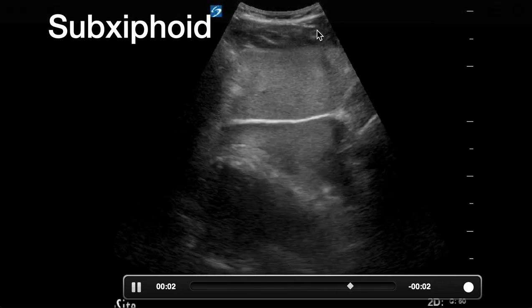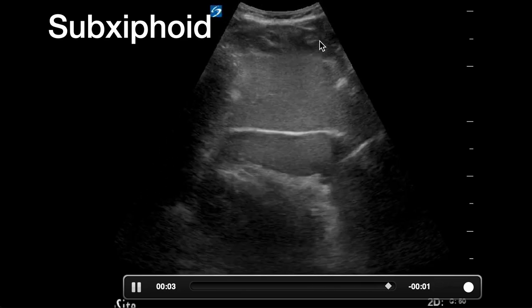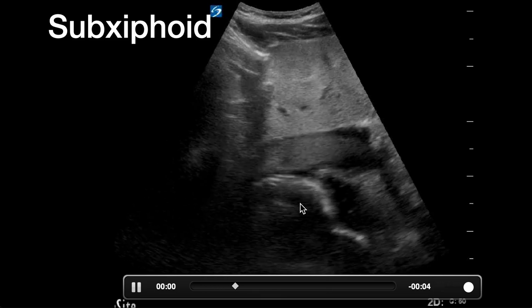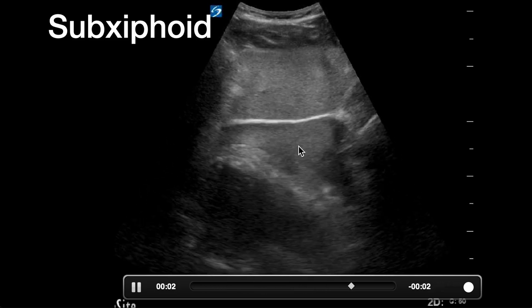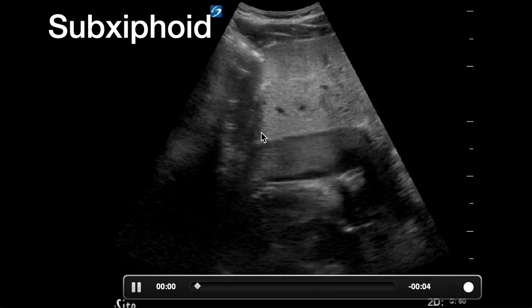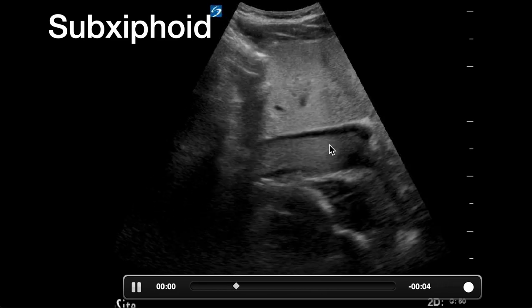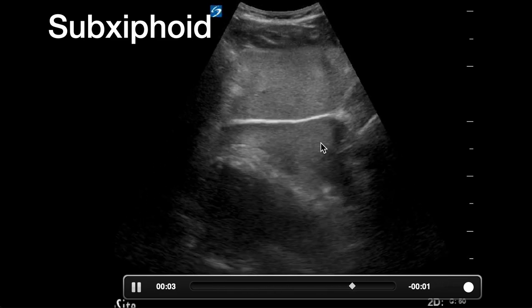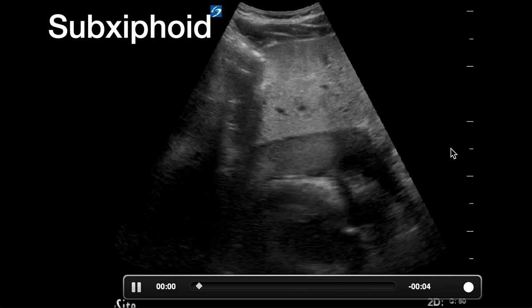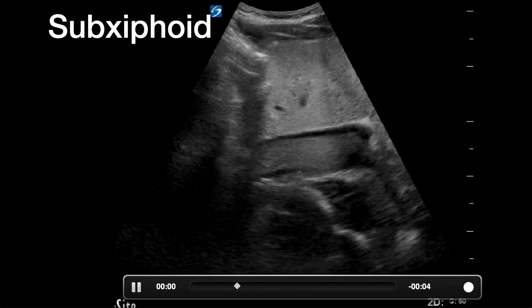You'll notice that the probe surface is much broader, and still pie shaped, but doesn't come to a point. And here we're scanning through the liver. We see the heart down here, way down here, but in between you see this hyperechoic structure moving within some hypoechoic or black fluid, and that is actually a clot forming acutely in the setting of trauma, leading to a pericardial clot, which could potentially be very detrimental to this patient if not found quickly, as was found in this patient who went to the operating room and had this evacuated and did well.